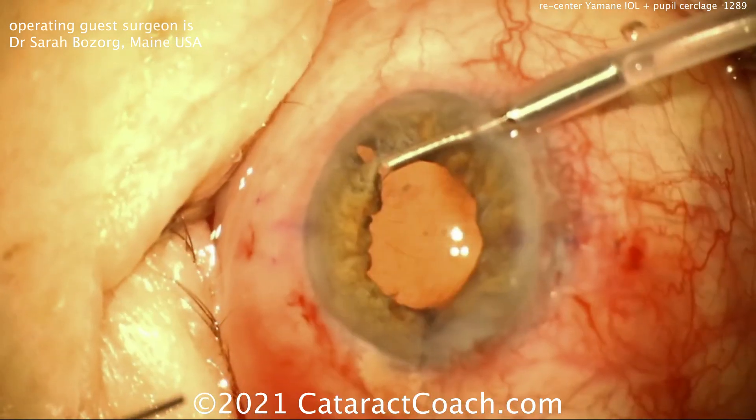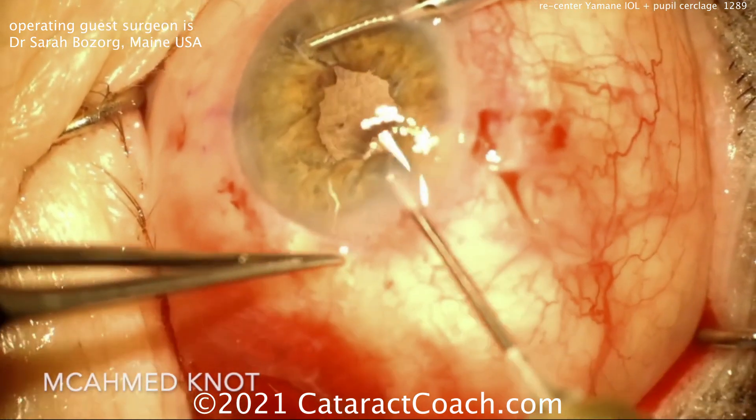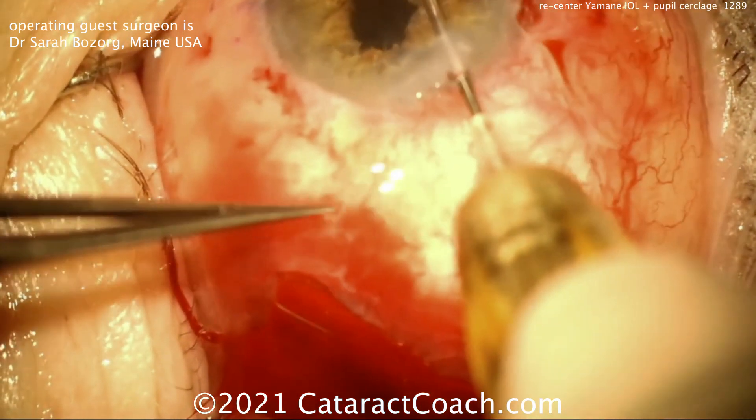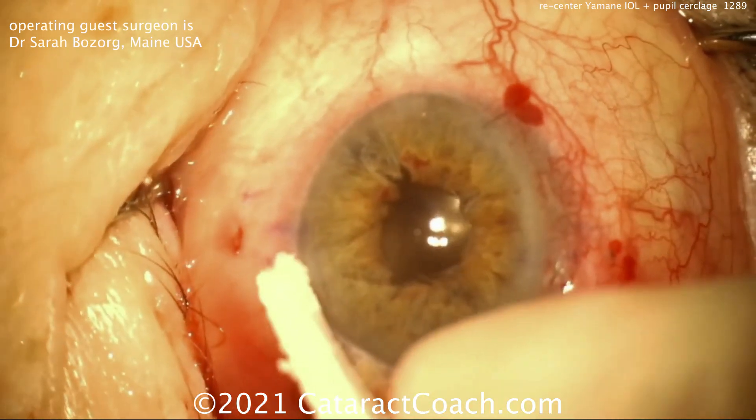Now here comes her cerclage pupilloplasty. Nice technique here using long throws — this 10-0 prolene it looks like — to achieve about a 4-millimeter pupil, which would be ideal. And you can see at the end here, that is a beautiful result.